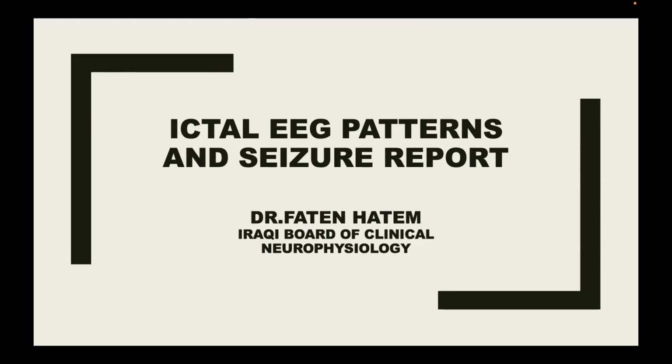Our second lecture, I think we start talking about this very informative lecture. The second lecture of this meeting is Ictal EEG and seizure waveform. We are very interested in focal abnormalities in our EEG.